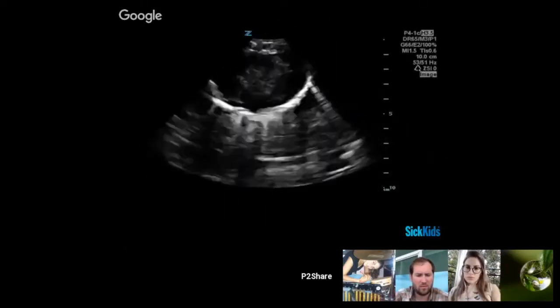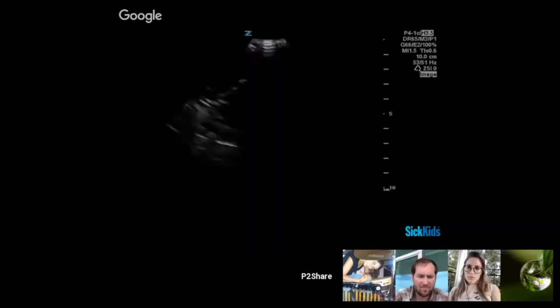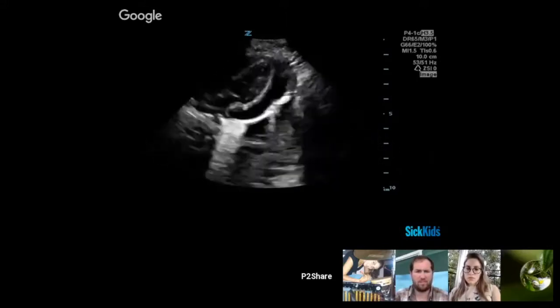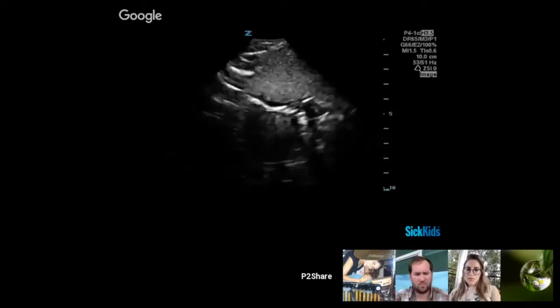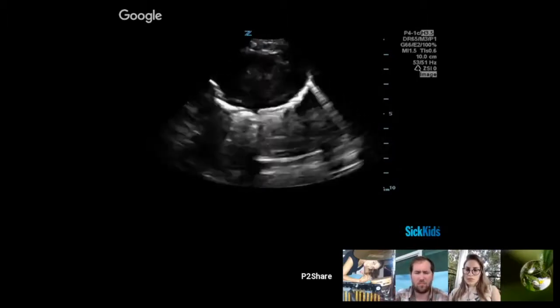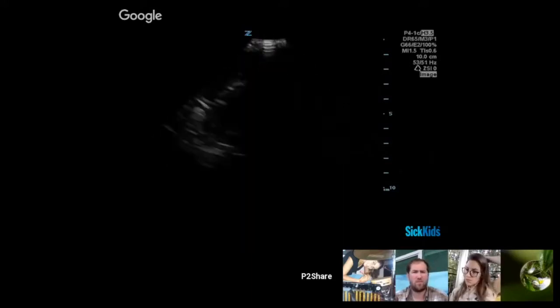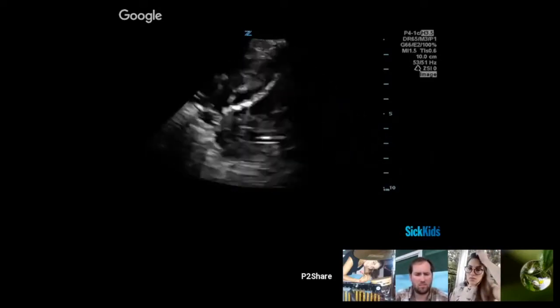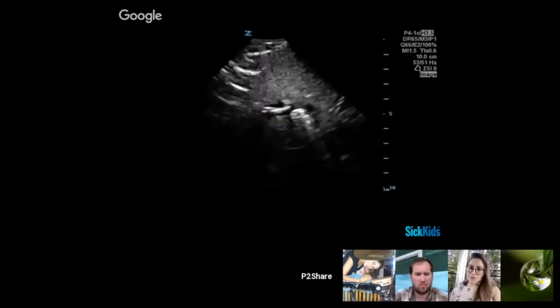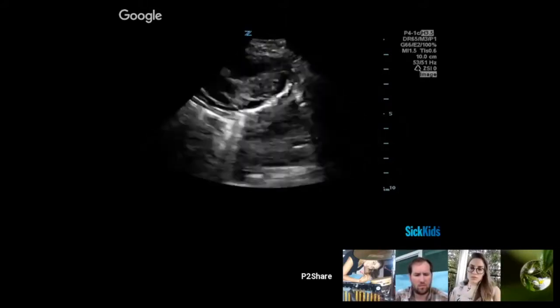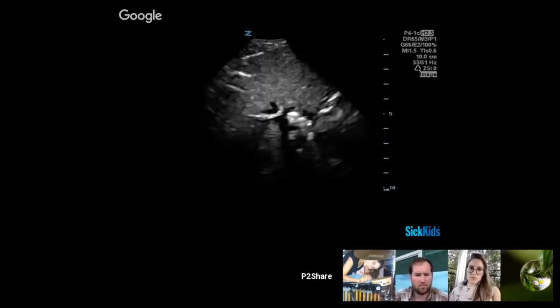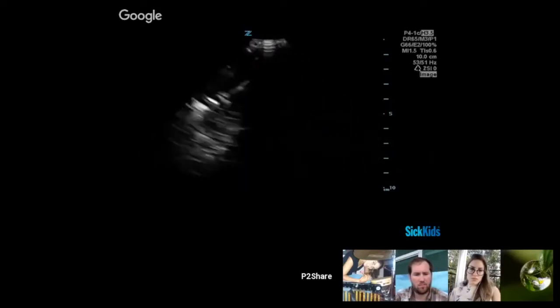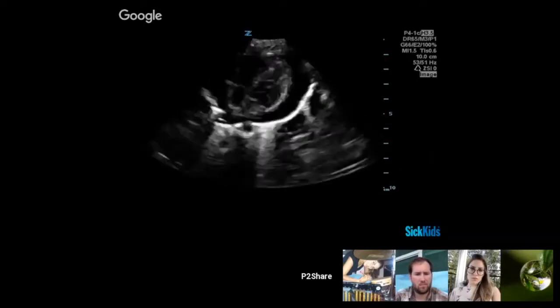Here's another one which is a bit more of a hemodynamically significant case. This is a very young baby, and this speaks to the challenges. If you look closely at this video, you'll see that the right ventricular free wall as well as the right atrium are kind of collapsing inwards in an unusual way. However, the baby's heart is going incredibly fast, so determining that at the bedside is less important than looking at your patient and being aware of their hemodynamic status — because if this is a kid that is actively hypotensive and having a really difficult hemodynamic picture, this is probably significant.